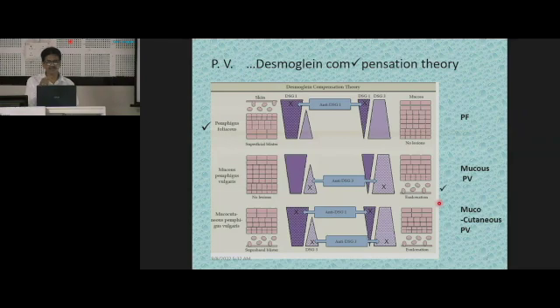The triangle is there and it is not reaching up to the top of the epidermis, and therefore in case of pemphigus foliaceus, desmoglein 1 is insufficient because anti-desmoglein 1 is attacking it, and desmoglein 3 is not sufficient to give integrity, and that's why you get a subcorneal or superficial blister in pemphigus foliaceus.